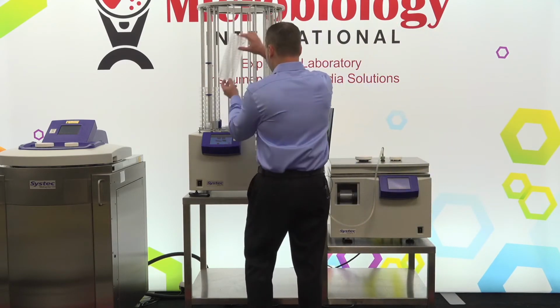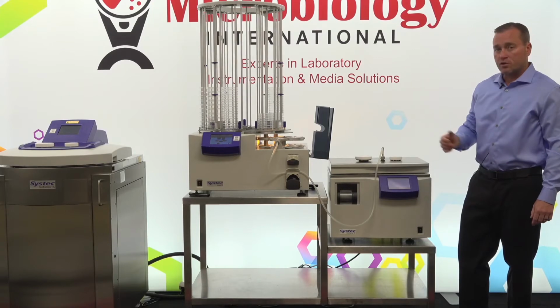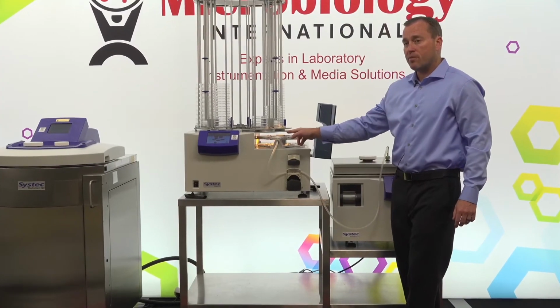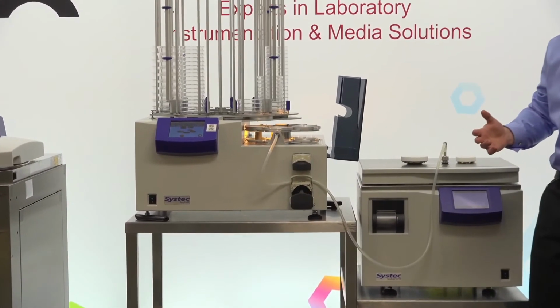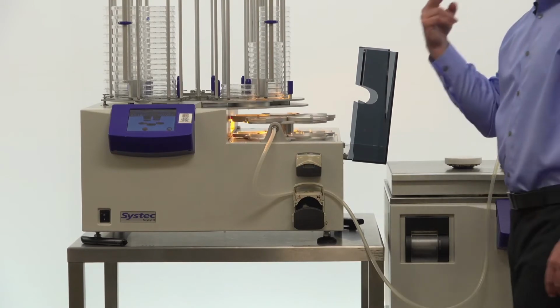I'm going to move one stack of plates over so that it can find that empty column, and then it will pause the pouring. You can tell there is a white light on inside of the filling chamber. In this case, we have that for demonstration purposes. Normally that would be a UV light, but we put that white light in there so we're not blinding each other as we're looking at these.